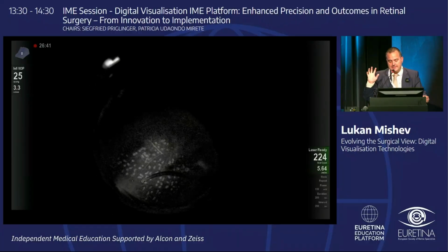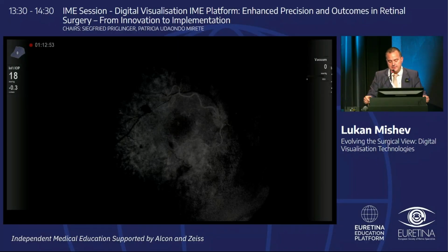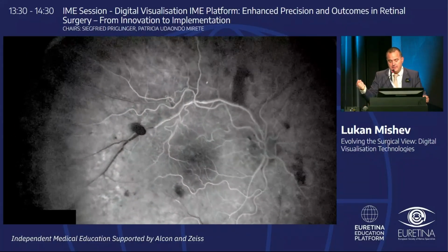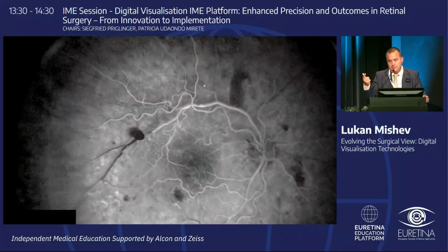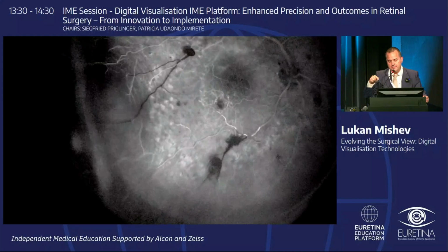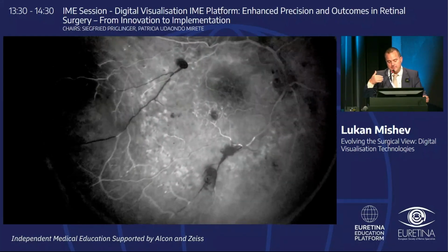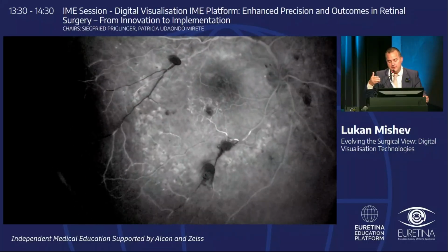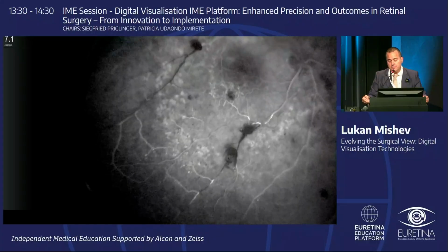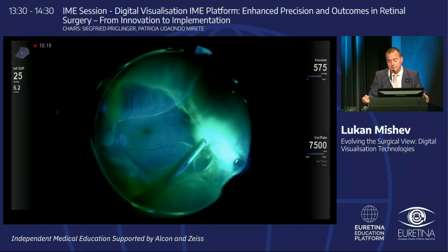There are not snapshots. Here, this is another phenomenon which is not often observed. We have blood in the vessel, but there is no perfusion. We can see the embolus traveling through the vessel, and when we indent or apply a massage in the periphery, suddenly we see a reperfusion. These are phenomena which we do not normally see with analog vision, so it's useful.